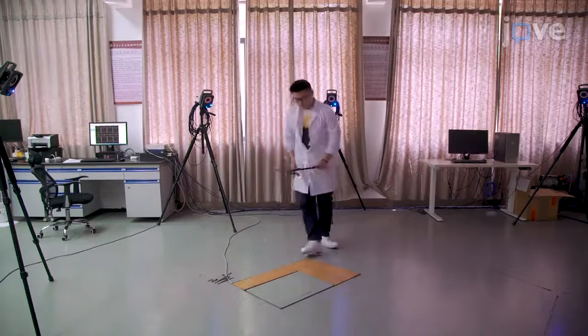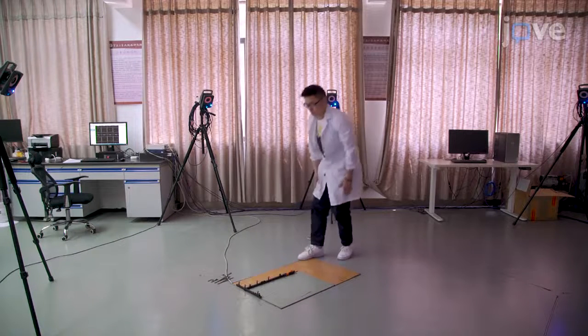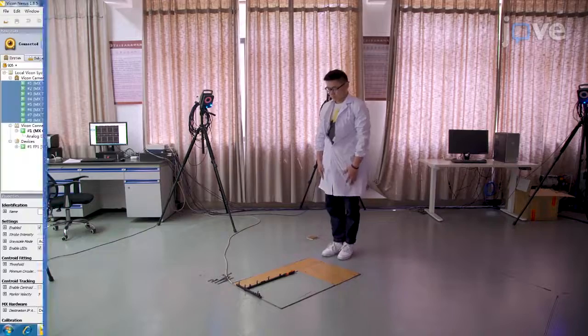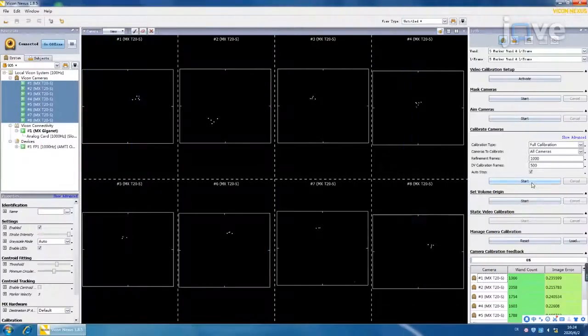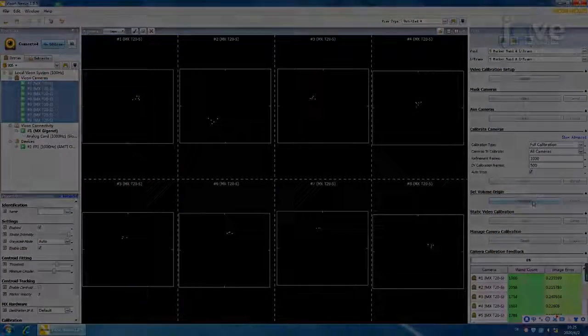To establish the origin of the coordinates, place the T-frame in the center of the camera field of view. In the Tool pane, click the Start button in the Set Origin section.